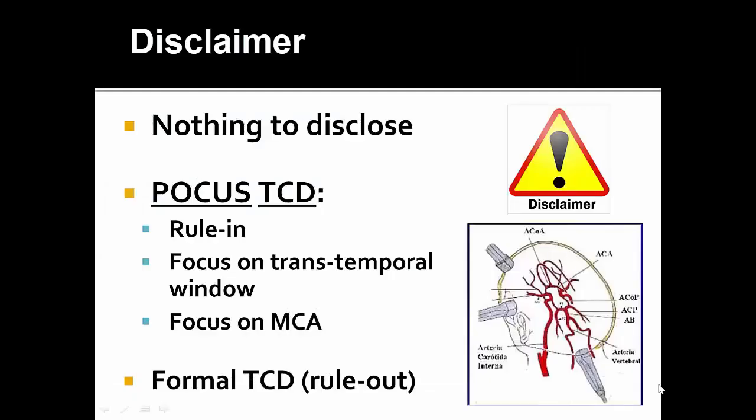Just as a disclaimer, I have no professional or financial disclosures to note. However, it is important to realize that POCUS TCD is primarily used as a rule-in for neuropathology in the neurocritically ill patient.